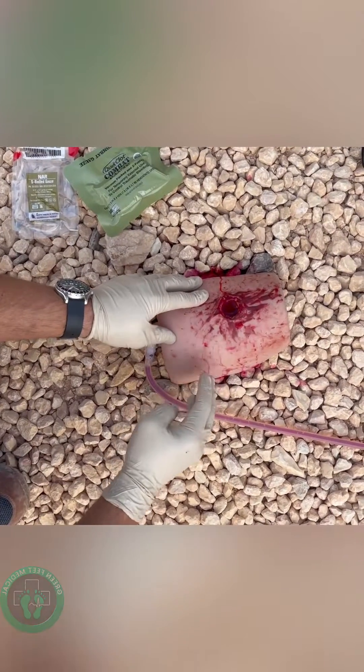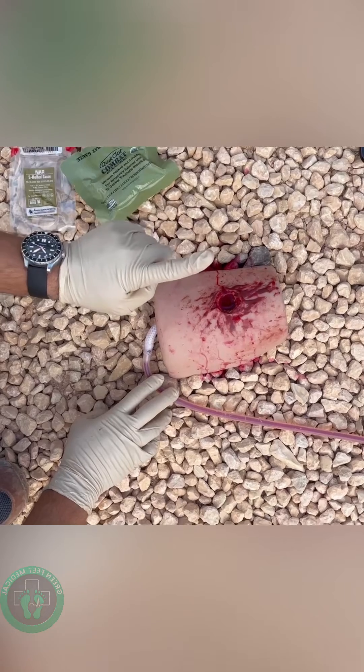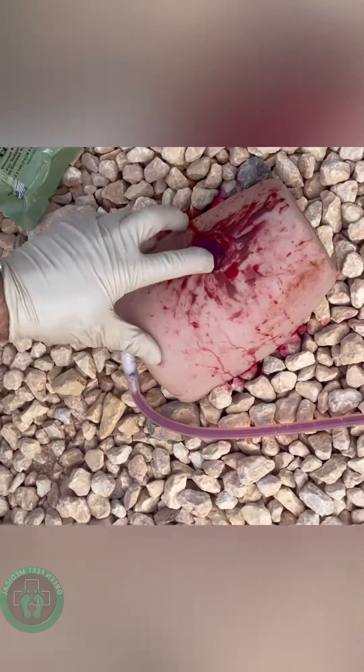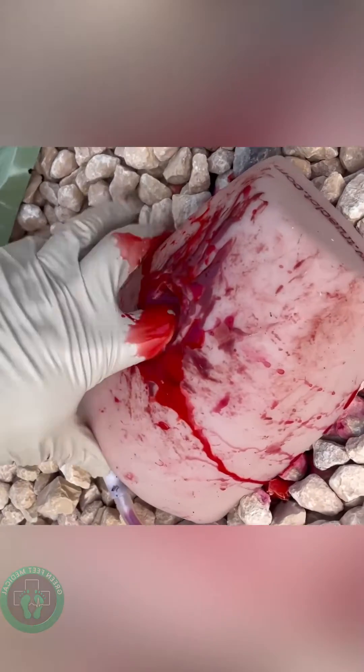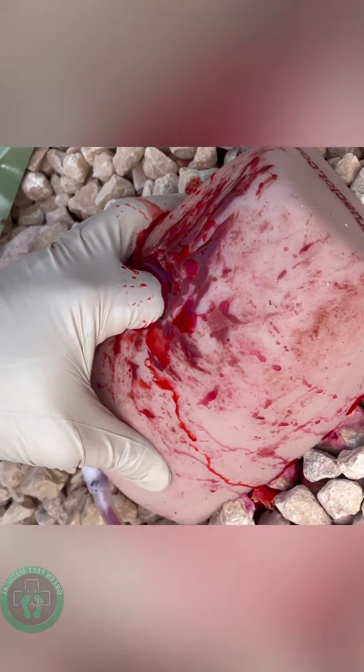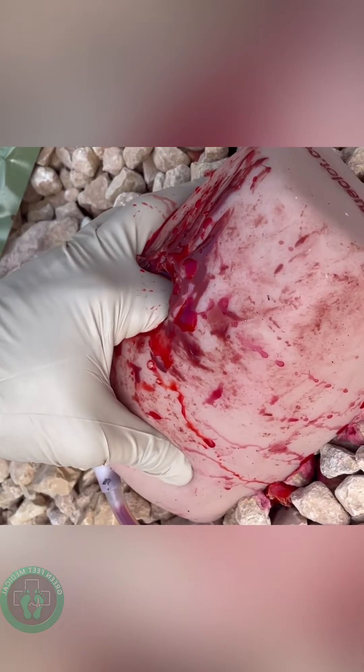My placement — I like to be towards the heart so that we can hook and not push with my fingers. You have a lot more strength there. So I'm going to hook into the wound, go towards the heart and then against the bone, knowing the anatomy of the arteries. Once I've done that, I'm going to find the source of the bleed.